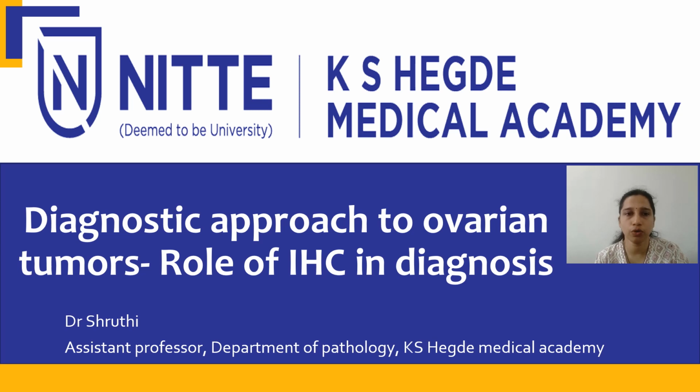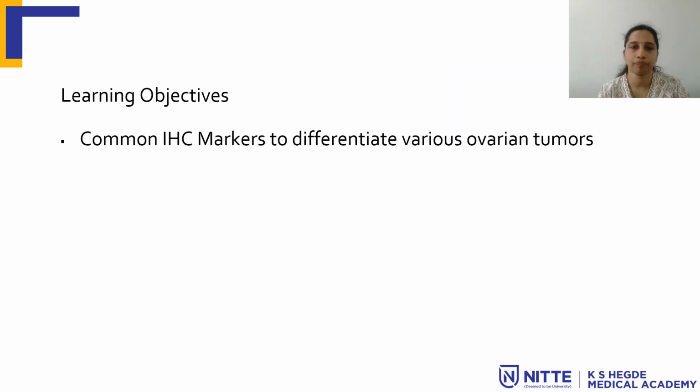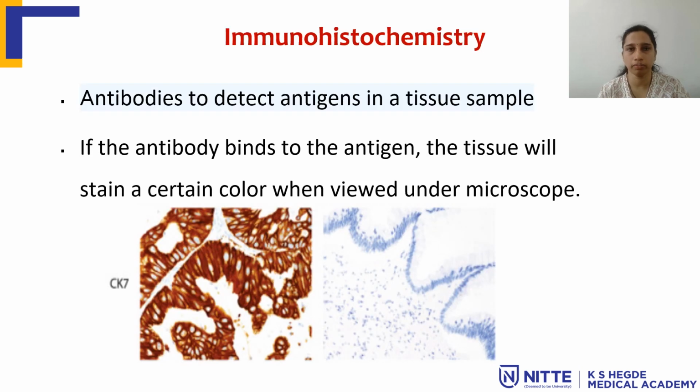Welcome to the e-learning module on pathology of ovarian tumor. This is the continuation of the diagnostic approach for an ovarian tumor. In this session, I'll be talking about the role of IHC in the diagnosis of ovarian tumors. The learning objective is to enlist various common IHC markers to differentiate various ovarian tumors.